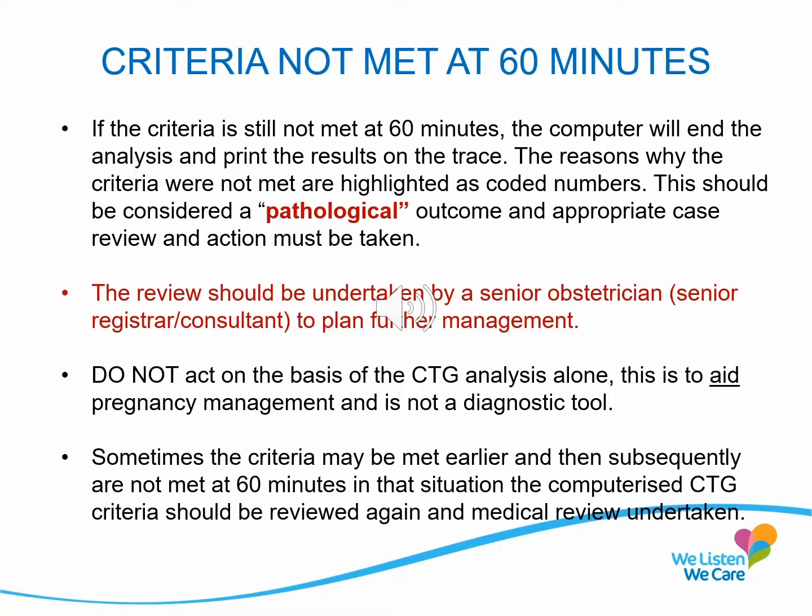There are situations, for example, where the gestational age is between 26-28 weeks or there is a lot of signal loss, where the criteria may not be met. However, there are fetal movements and it is clearly not a pathological CTG in that context. However, this varies depending on the situation. Sometimes the criteria may be met earlier and then subsequently are not met at 60 minutes. In that situation, the computerized CTG criteria should be reviewed again and medical review should be undertaken.